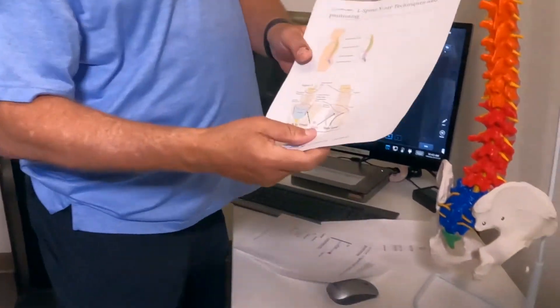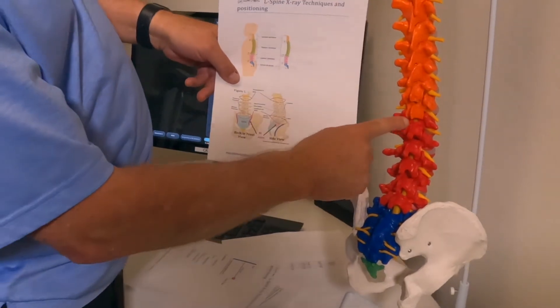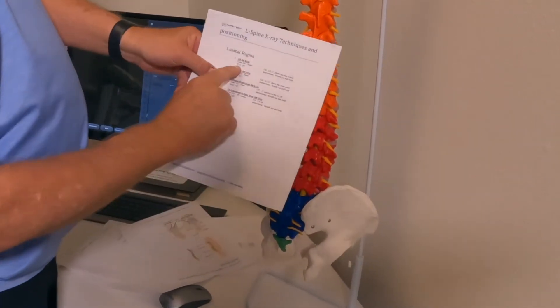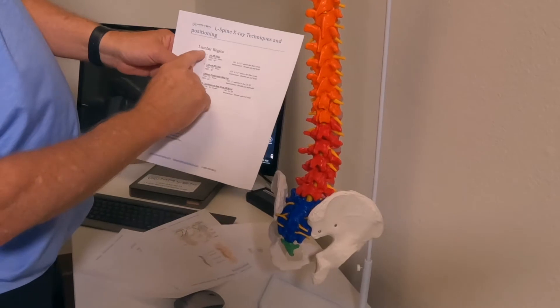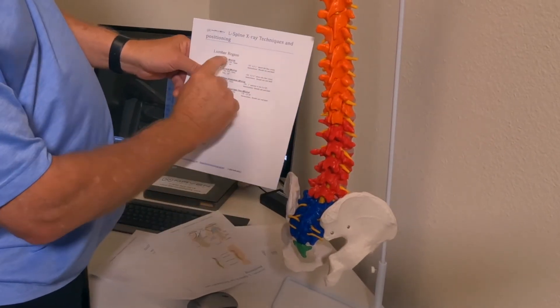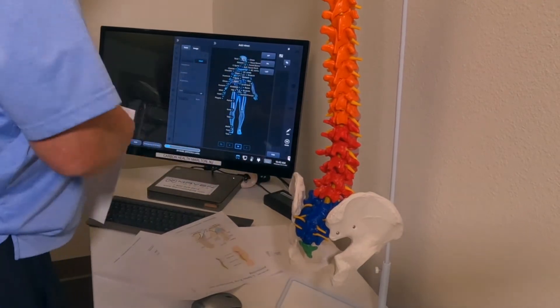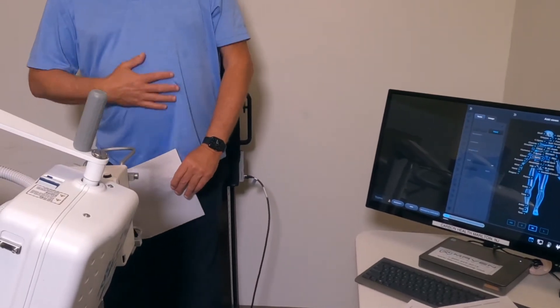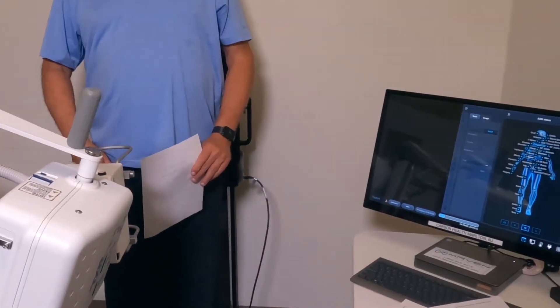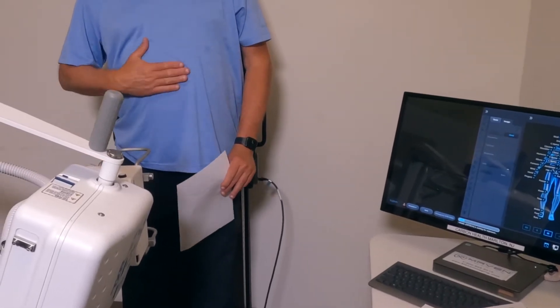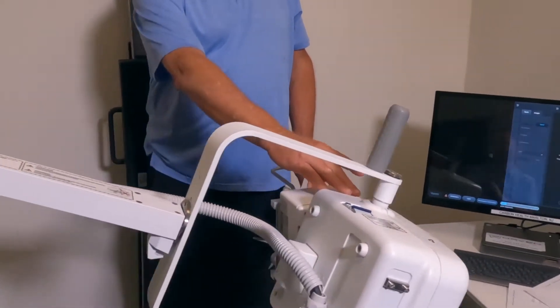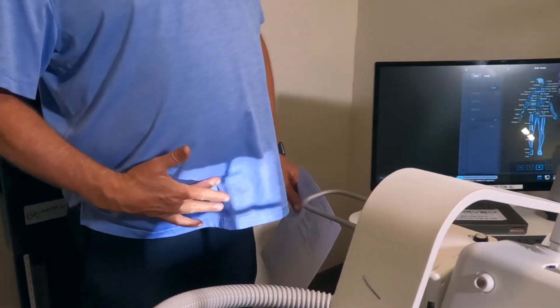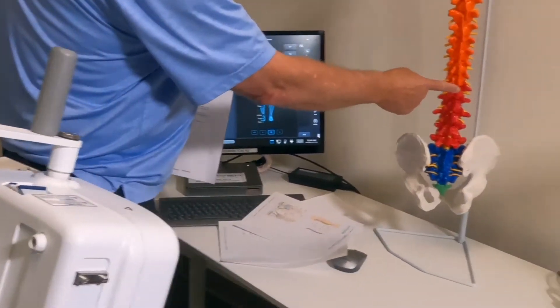If we look at my diagram, when we're shooting an AP shot of the lumbar L-spine area, the AP shot is where the patient's front stomach faces forward and your back is pushed against the DR panel. See how I'm positioned here, and if I hit the light you should see where that light is positioned to the L-spine.